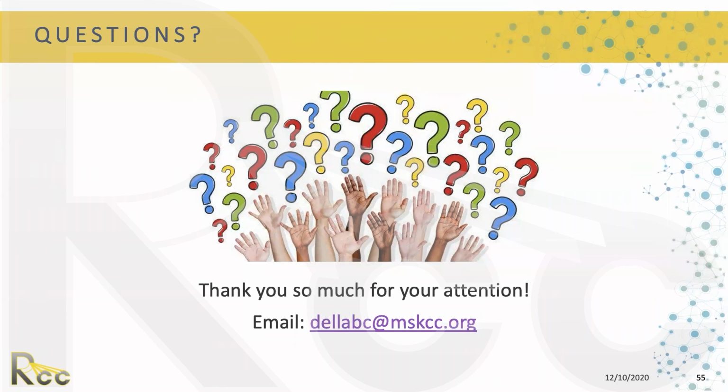Yeah, that's a good question. And actually, yes, you know that you need to crop the PTVs that go outside the body, because then your algorithm will be really confused if you have something outside the body.